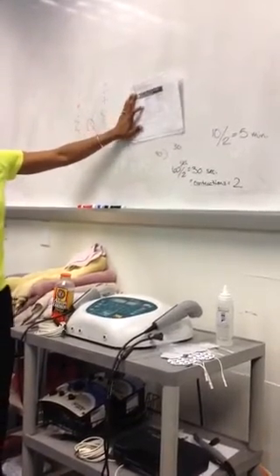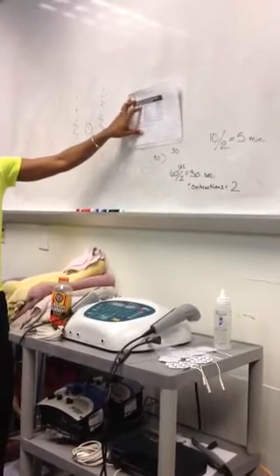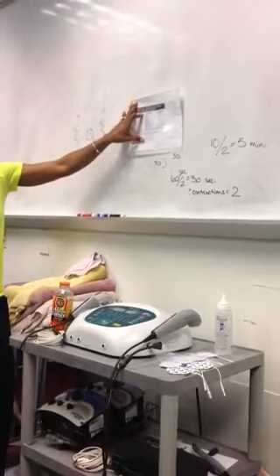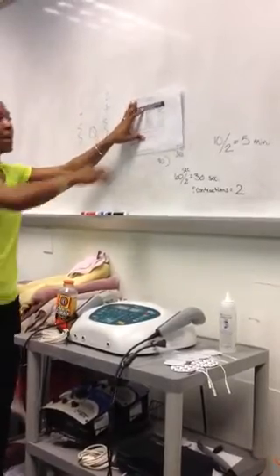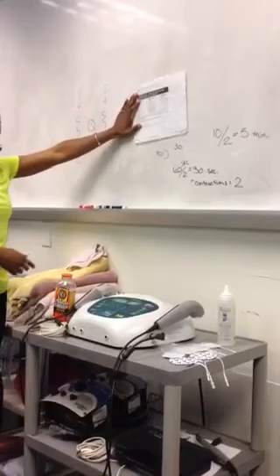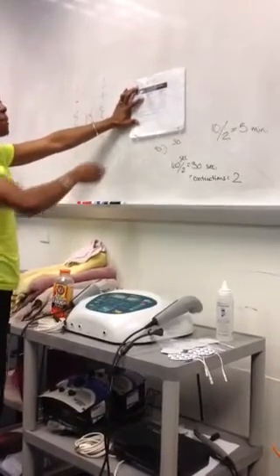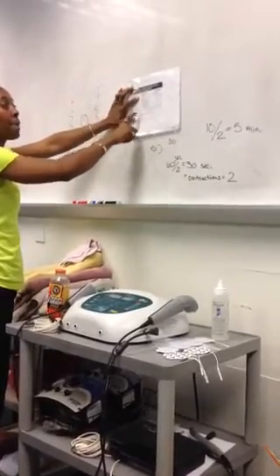With the frequency, we have 1 and 3 megahertz. Which one is superficial? Which one is deep? I mean, deep is 1, and superficial is 3. Okay? So with our 1 megahertz, 1 is which one again? Deep. Good. So 1 megahertz, okay, is our deep treating segment.